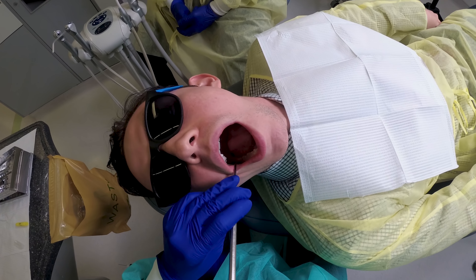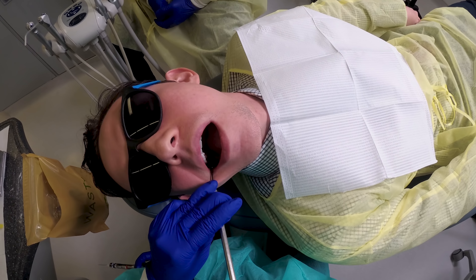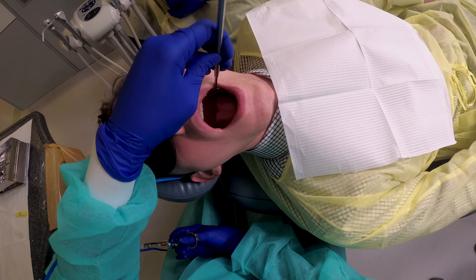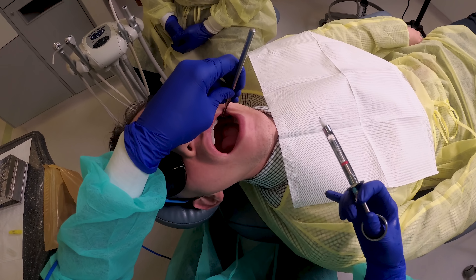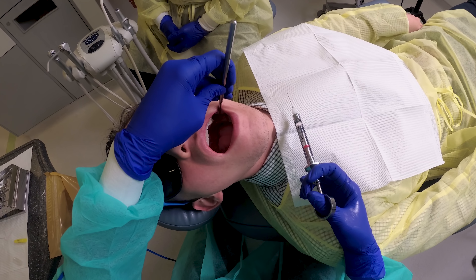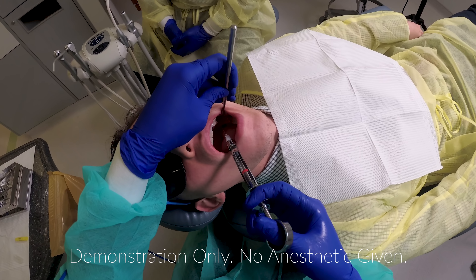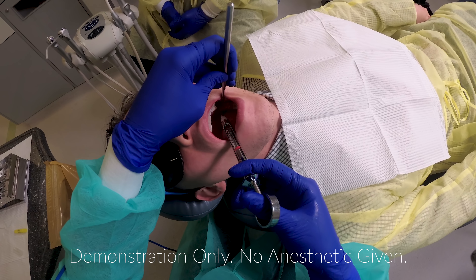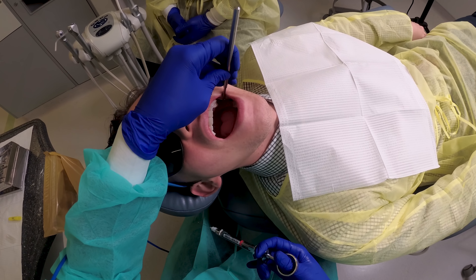When using the syringe, it is important where you position yourself so as to ensure safety and avoid unnecessary patient anxiety and fear. In general, the needle should be out of the patient's line of sight and pointed away from you or any assistant you may have. Be aware of your surroundings, especially when working in a learning environment such as a dental school. You should retract with an instrument or mirror whenever possible, as you do not want a hand in close proximity to an uncapped needle intraorally. Be aware of the increased risk and avoid hand retraction whenever possible.